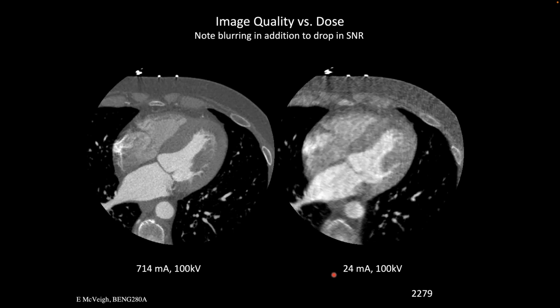And so you have to get through that first, and then there's lots of bad pixels, and there's boundaries between the pixels that have lower sensitivity, so you need to normalize, because when you look at the raw data from an object, as we did in some slides back there, you can see the detector elements and everything. But you can get it.